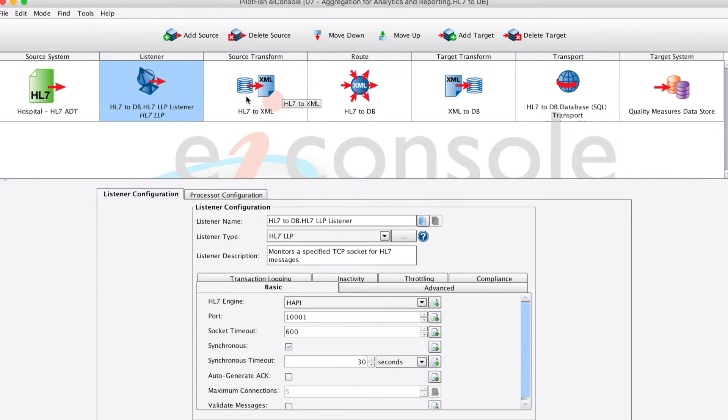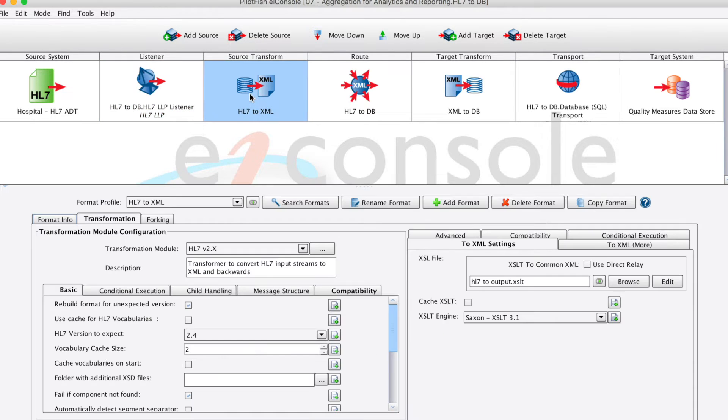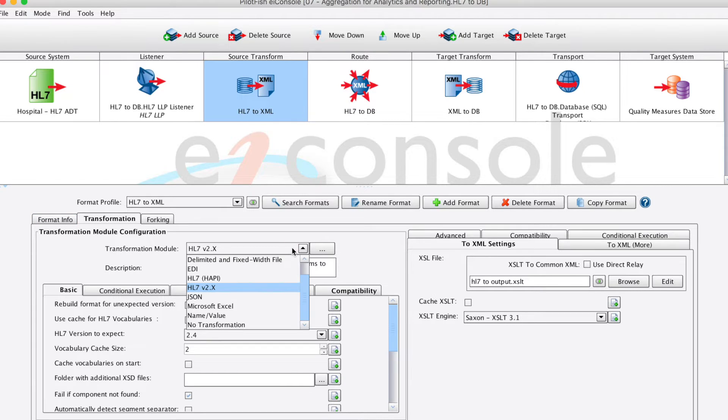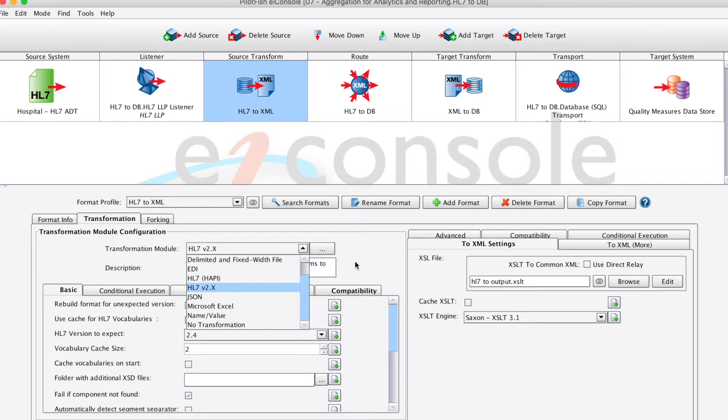We'll then move on to the source transformation. This will take the HL7 data and convert it into a generic XML representation. We do this by using the EI console's HL7 to XML transformation module. In this drop-down, we'll choose HL7 2.x, define our version, and then we'll move on to the logical transformation.